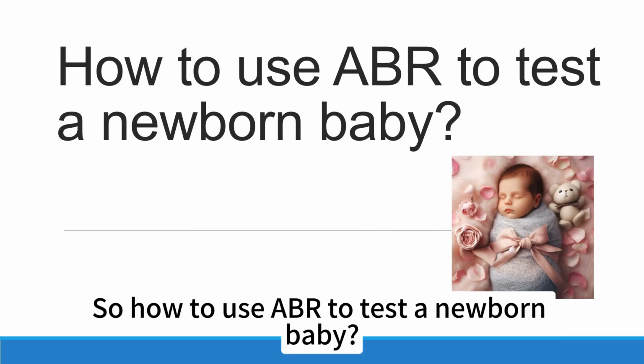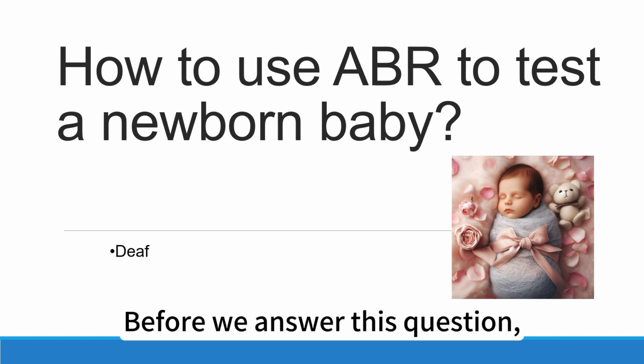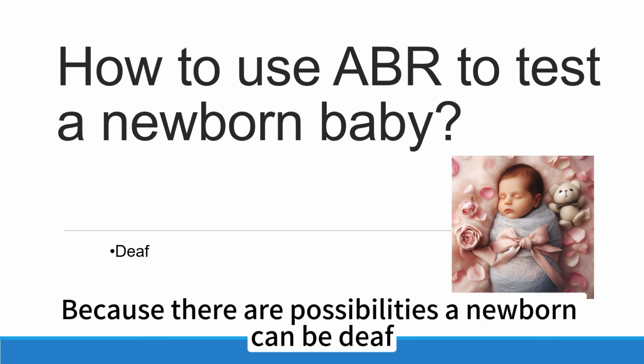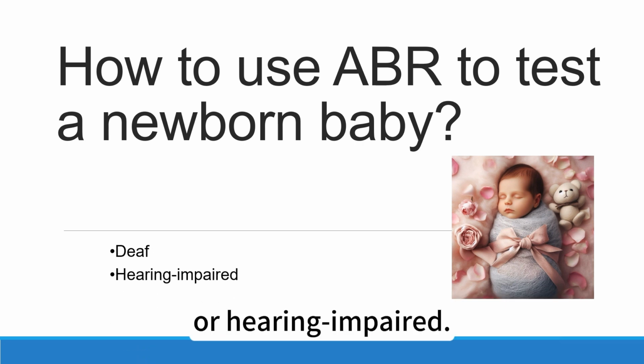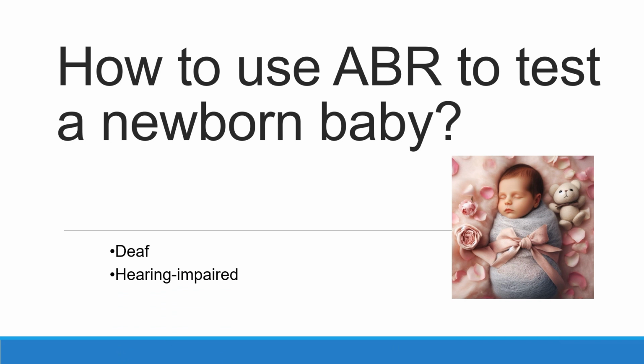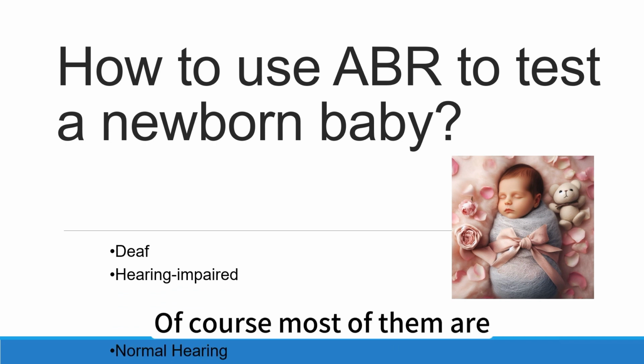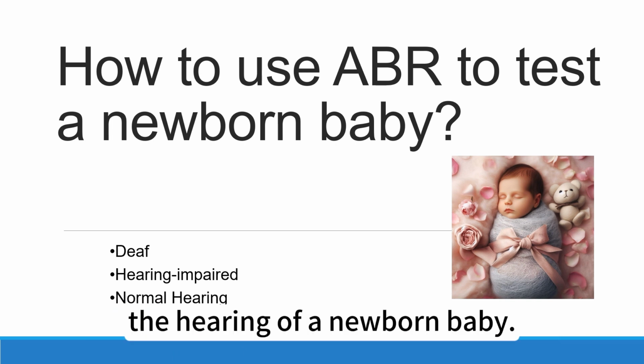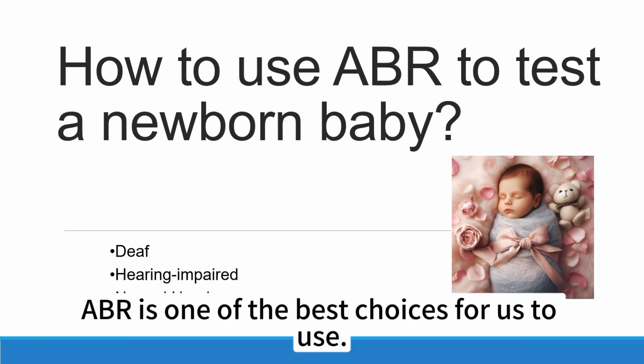So how to use ABR to test a newborn baby? Before we answer this question, why do we even use ABR for newborn screening? Because there are possibilities a newborn can be deaf or hearing impaired. Of course, most of them are normal hearing. So we need to screen the hearing of a newborn baby. ABR is one of the best choices for us to use.